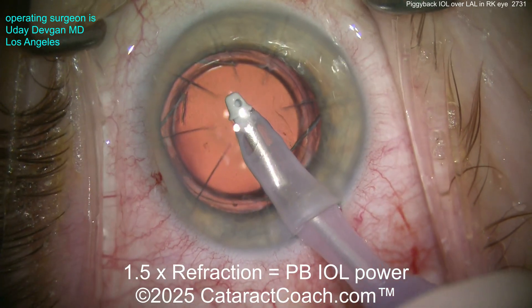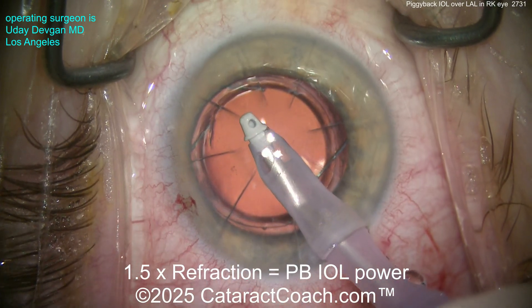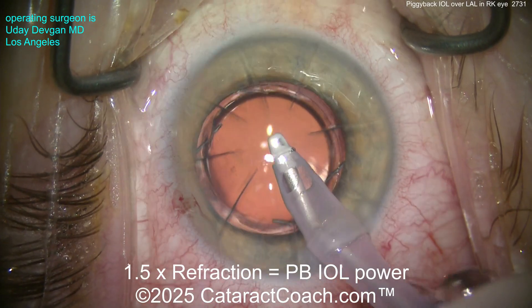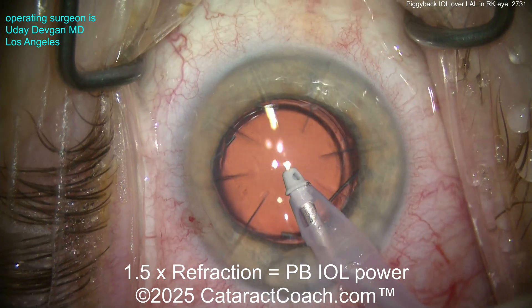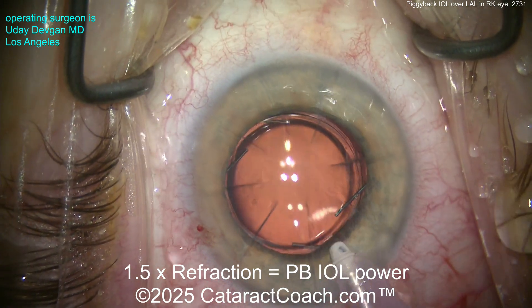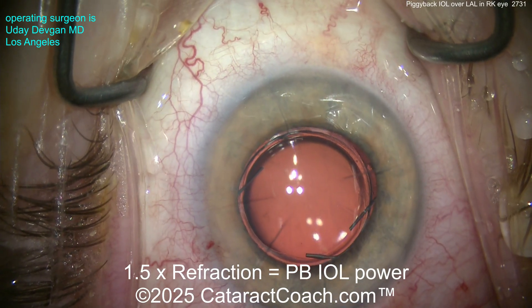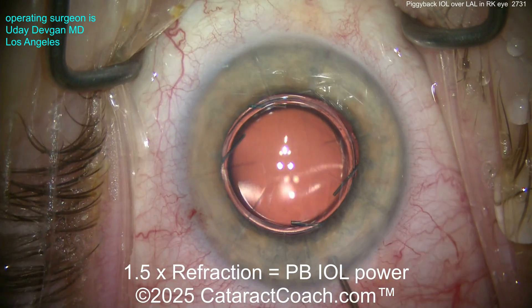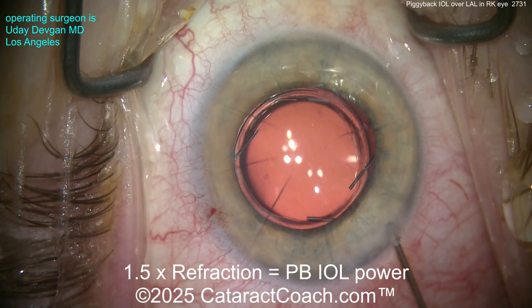So what's the power? One and a half times the refraction equals your piggyback IOL power. If the patient had a post-op refraction of plus two, what's the piggyback lens power? One and a half times two is three. So your piggyback lens power would be plus three. You've got to do more than the refraction — one and a half times the refraction is what you put in the piggyback.